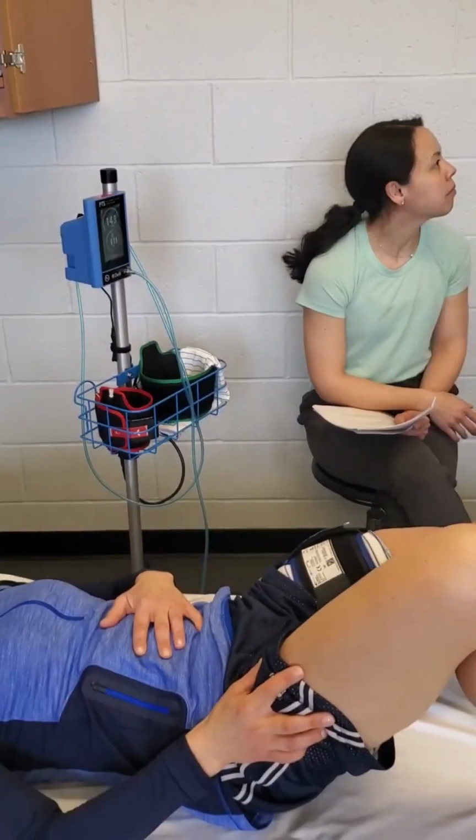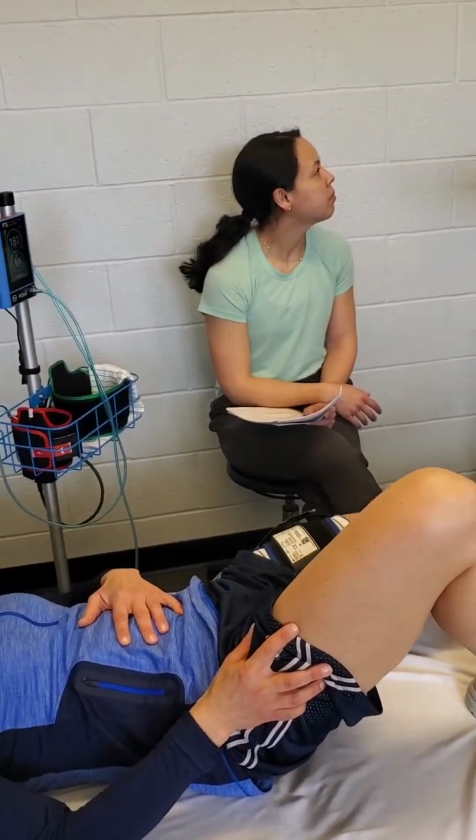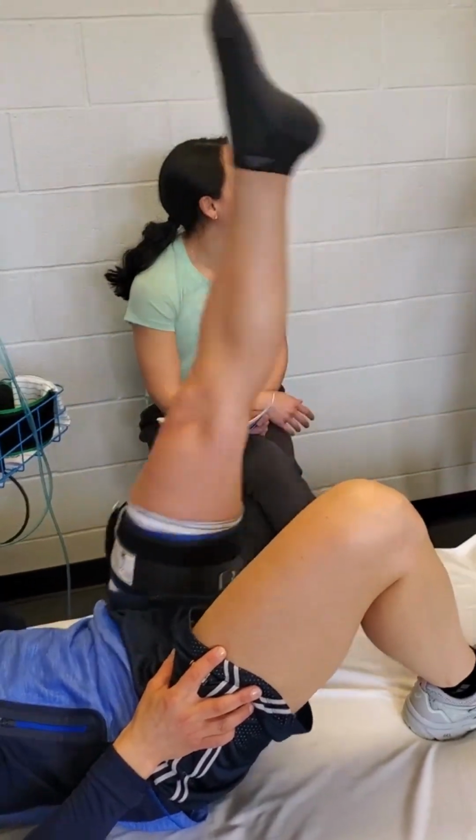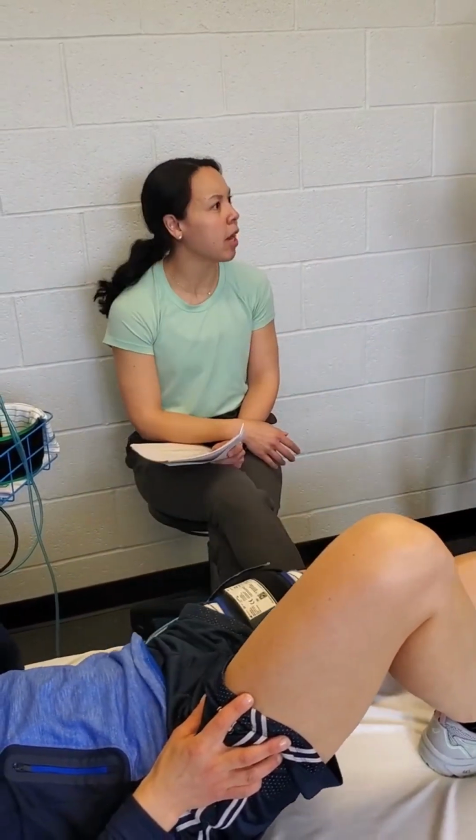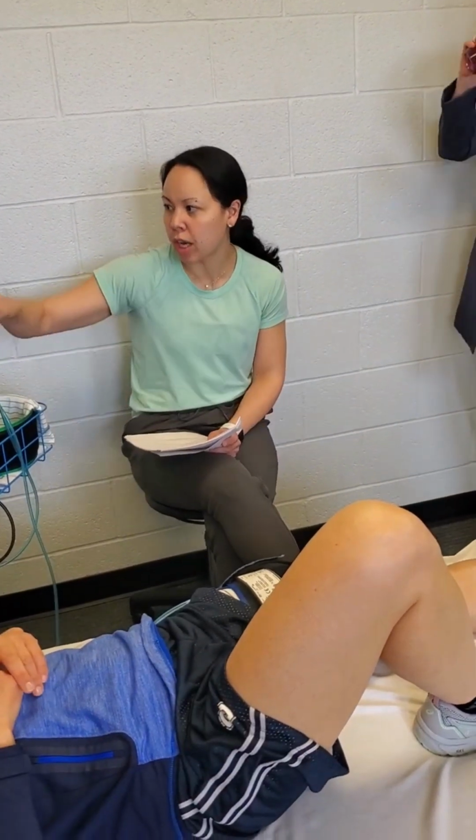Do they ever say you could leave someone with this going on and expect them to touch the rest button on the machine? You can certainly instruct the patient to do that, or count it. I would say once they're comfortable, have them count to 15, over a couple of sessions.